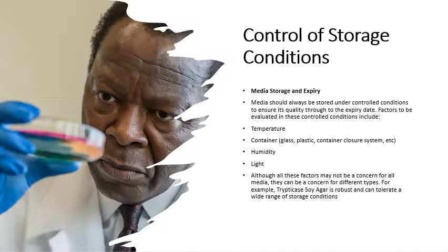Then we control the storage condition. Media storage requires controlled conditions, which are temperature, light, humidity, and so on, to maintain quality until the expiry date of the media is achieved.